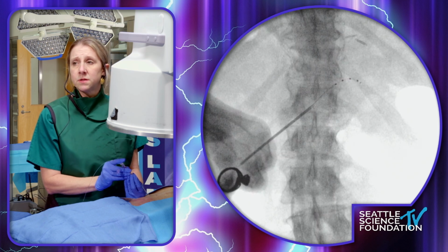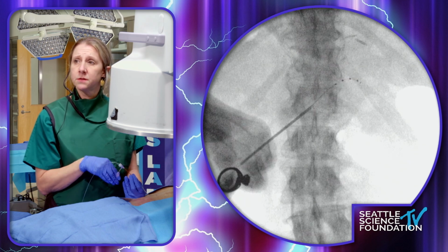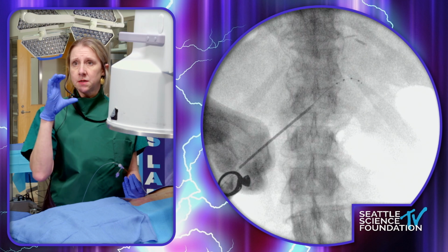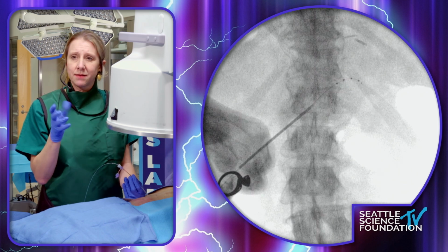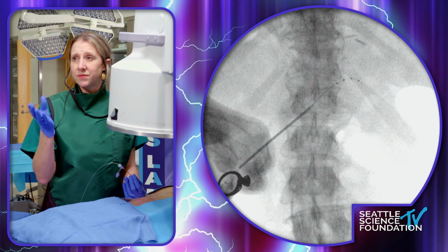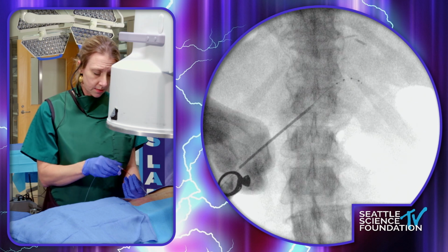Okay. So stop, please. It's really trial and error. It's just gentle tapping pressure. You can see gentle tapping pressure if you do encounter one of those transforaminal ligaments, and you usually will, just rotating the assembly so that you can take advantage of the curvature of the rigid introducer sheath.